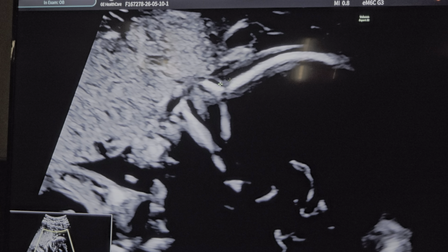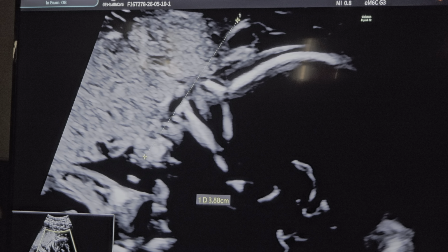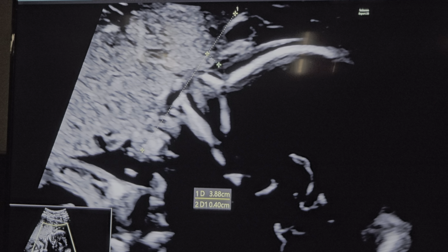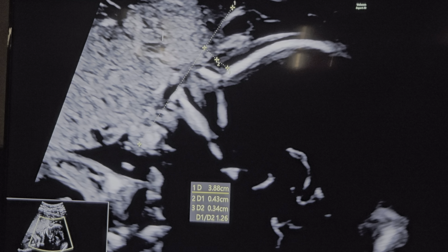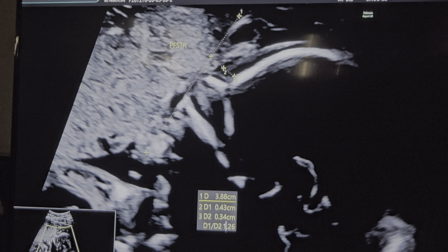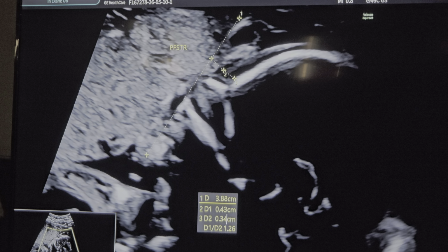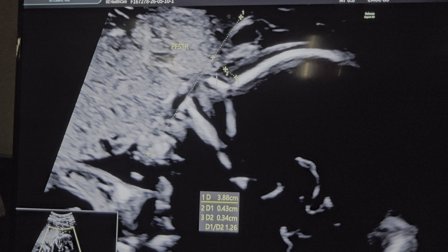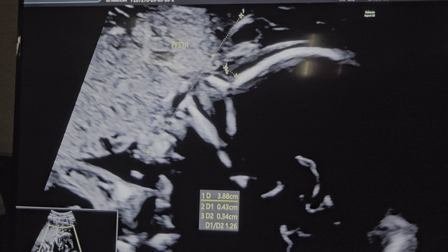So what do I do now? I establish the mandibulomaxillary line and I take the ratio of the prefrontal edema to the mandibulomaxillary line and call it the prefrontal skin thickening ratio. What is it called? PFSTR. And what is the value here? 1.26. Now how did I get 1.26? 4.3 millimeters is the mandibulomaxillary line extension to the skin and prefrontal.